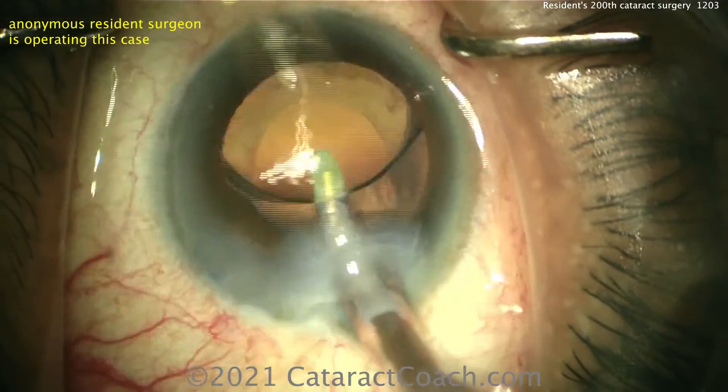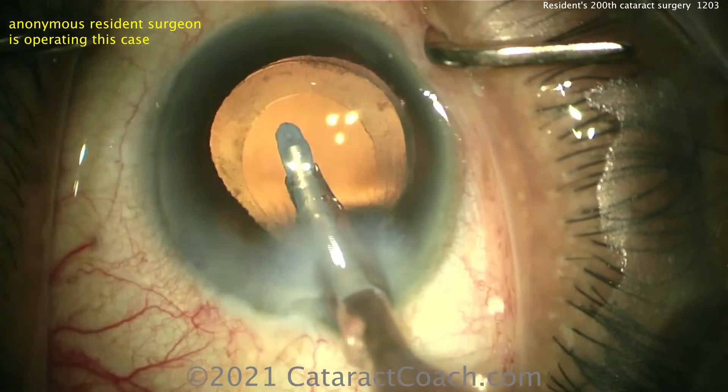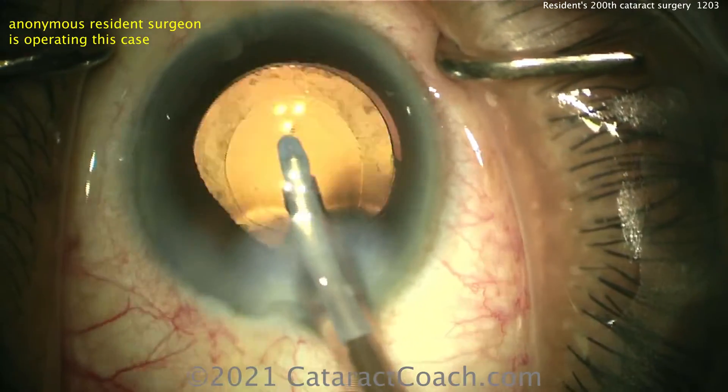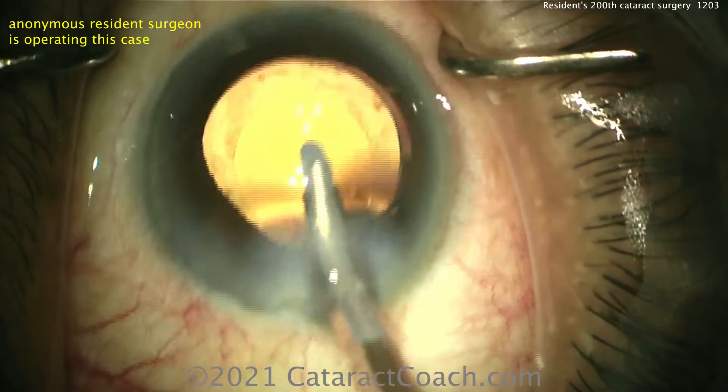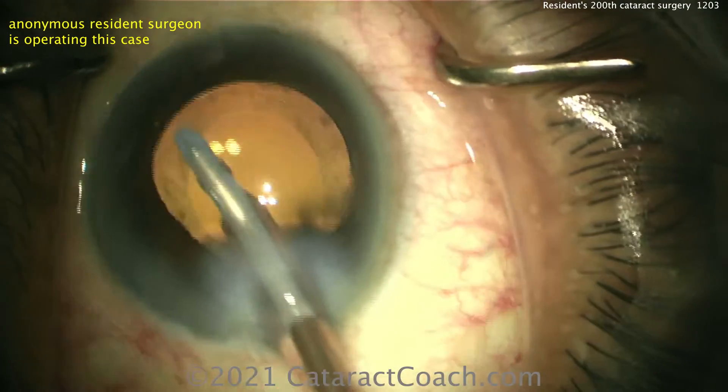Good job — you read my mind! You can obviously tell I'm watching this video for the very first time together with you; we are recording this audio commentary at the same time that we're watching it for the first time. Cleaning that out pretty nicely.